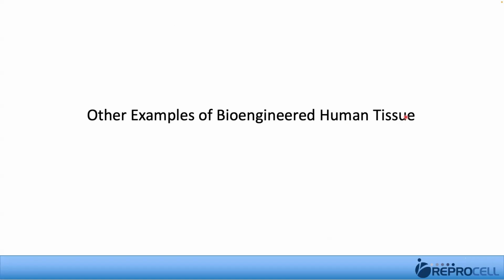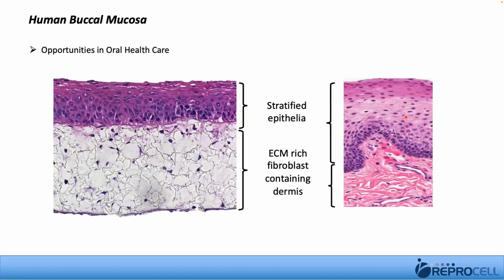So just very quickly to wrap up, I'll introduce two more technologies. This is oral mucosa, two slides on each. So this is a stratified epithelia, but it's non-keratinized. So this is the inside of the mouth, so it's a wet epithelium. You can see very clearly here, stratified cell epithelium sitting on this bed of Alvetex with fibroblasts.